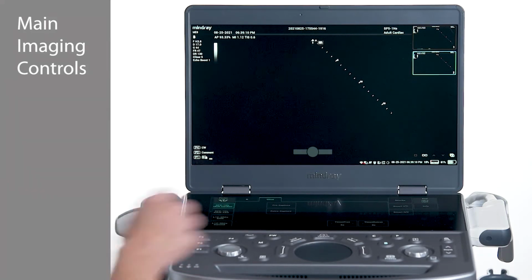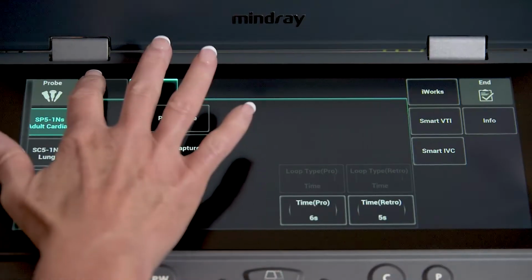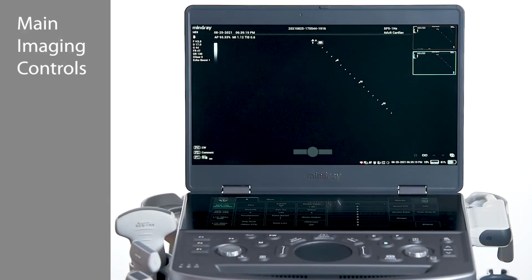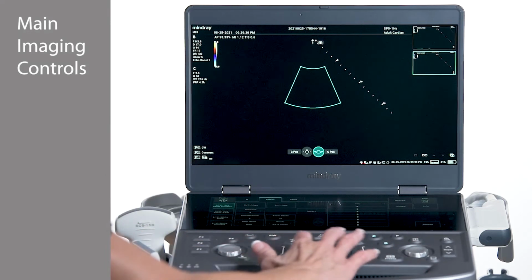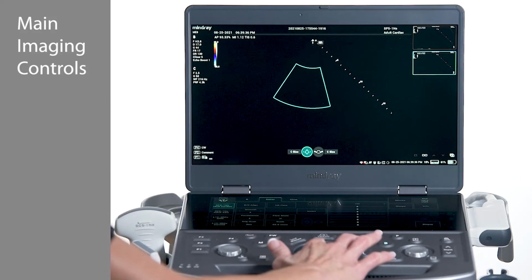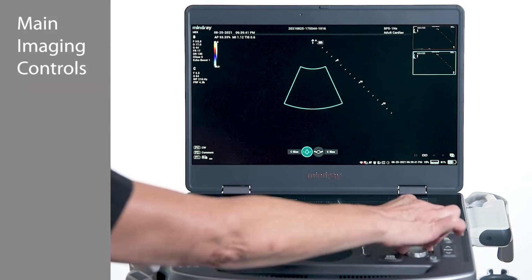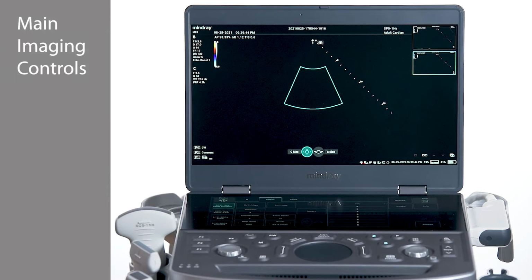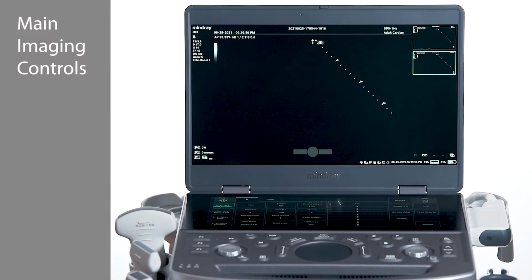Major modes are located around the touchpad for easy access. Imaging parameters for each mode will be found on the touch panel when each mode is activated. B mode is your grayscale imaging mode. To turn on color, tap on the C key on the right side of the touchpad. To change the size and position of the color box, use the trackpad and the set keys to the right and left of the trackpad. Now that color is activated, the gain wheel works to increase and decrease color gain. To exit color mode, either press the C key again or press the B key just below it.